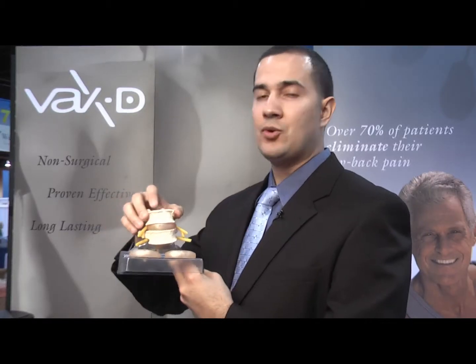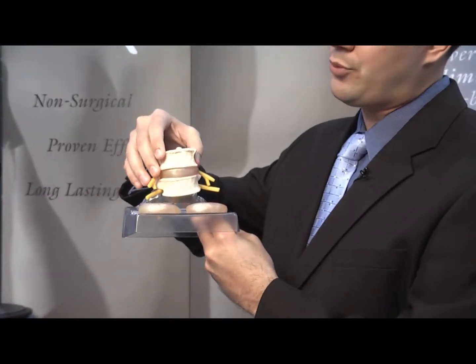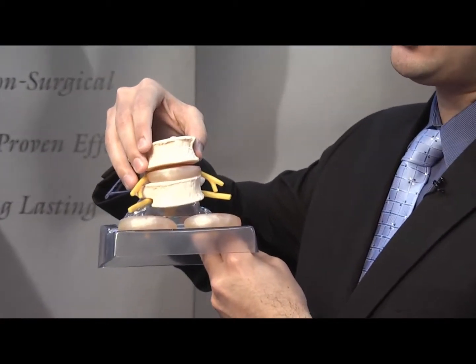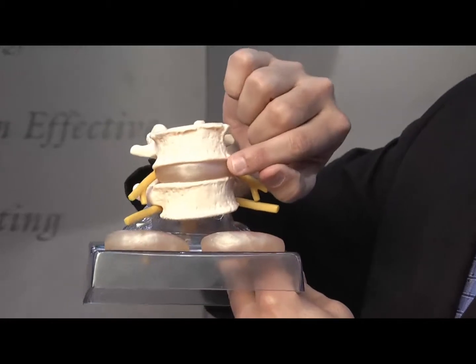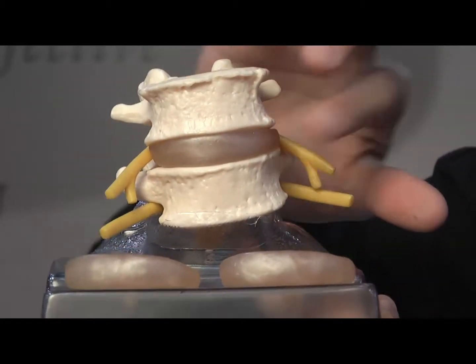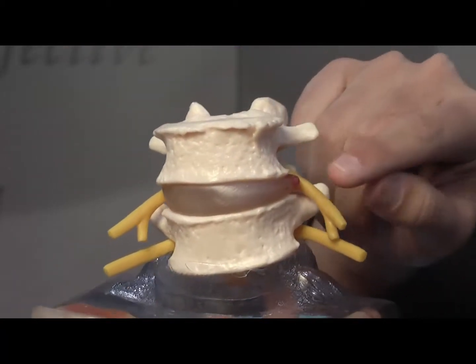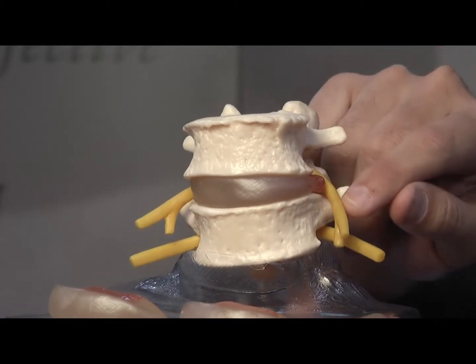It works by creating a distraction between the vertebrae. As it's decompressing, the vertebrae distract, creating a suction in the intradiscal area. By doing that, the bulging area in the disc will be sucked in, relieving the pressure off of the nerve.